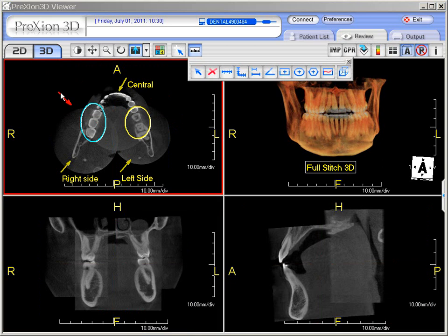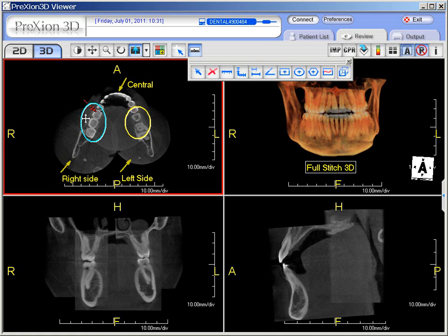Here in this three data set example, notice the areas of common overlap between all three of the separate scans, as you can see highlighted in the elliptical areas. This is achieved when we're doing the actual scan with the field of view set up and the scout x-rays to allow a little bit of this overlapping to get some common dentition.